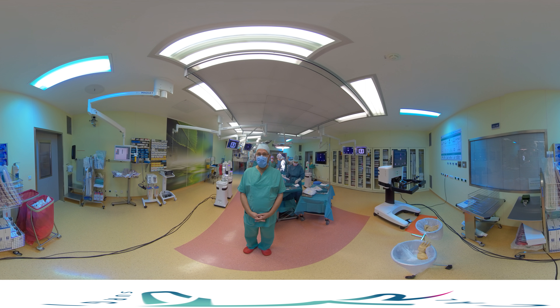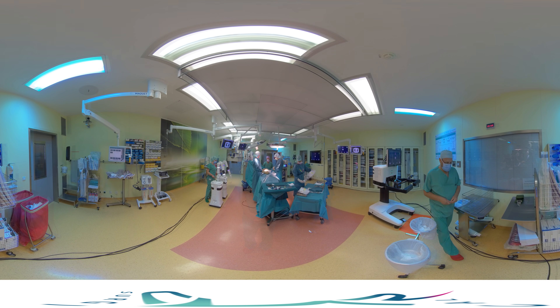Hello, I am Sven Seifert, head of the Thoracic Department at Chemnitz Hospital. I'm going to show you today a pulmonary wedge resection performed with the Versius Surgical Robot. This is a 360-degree video and you will be able to scroll around and explore the theater, or watch it with a VR headset.